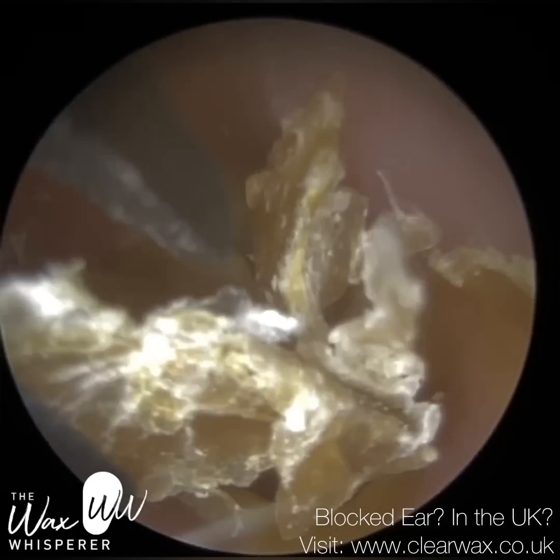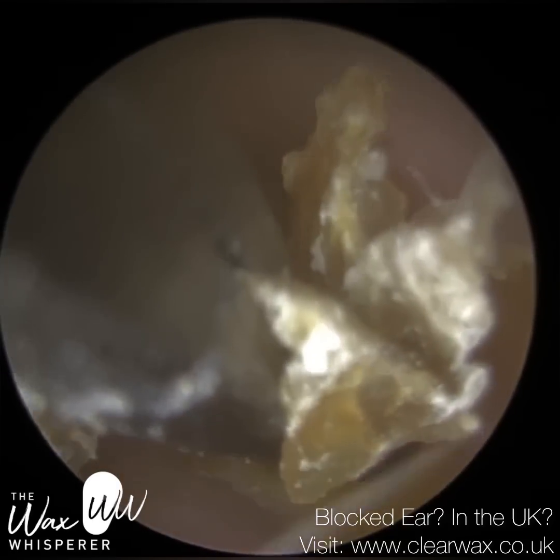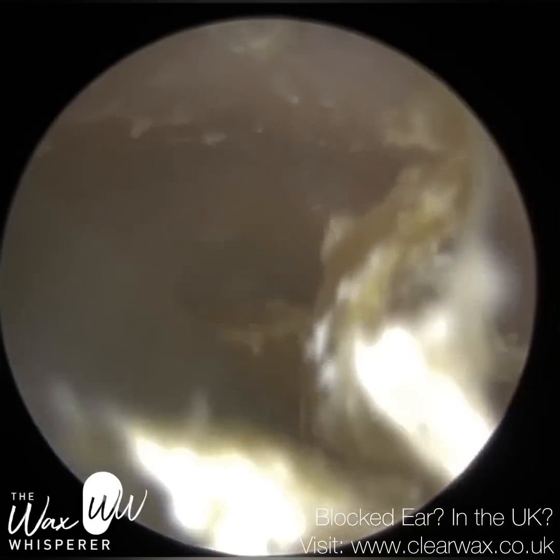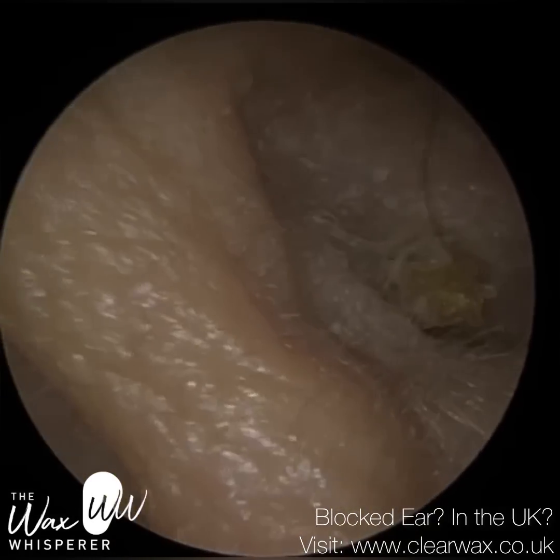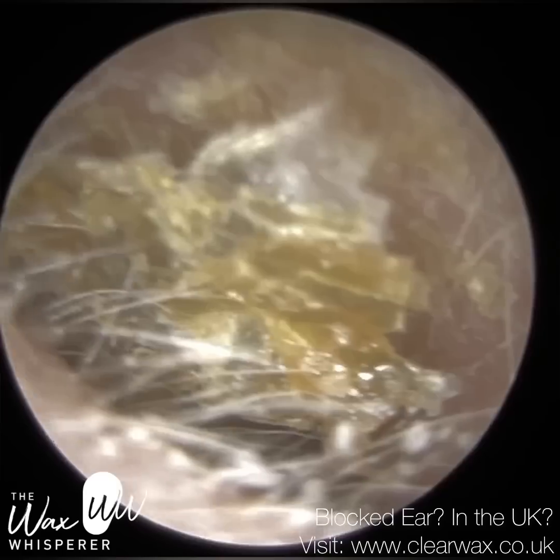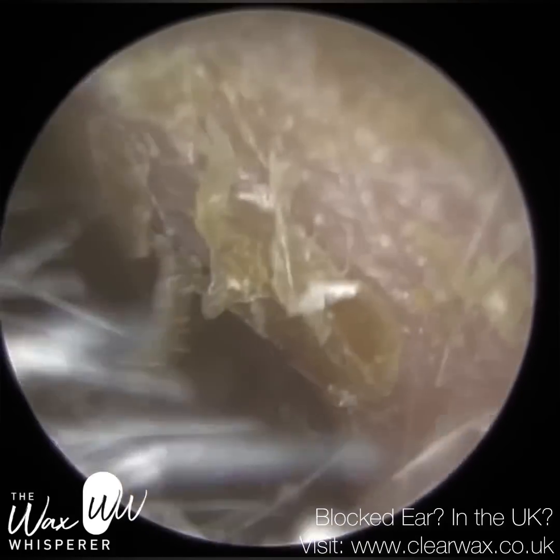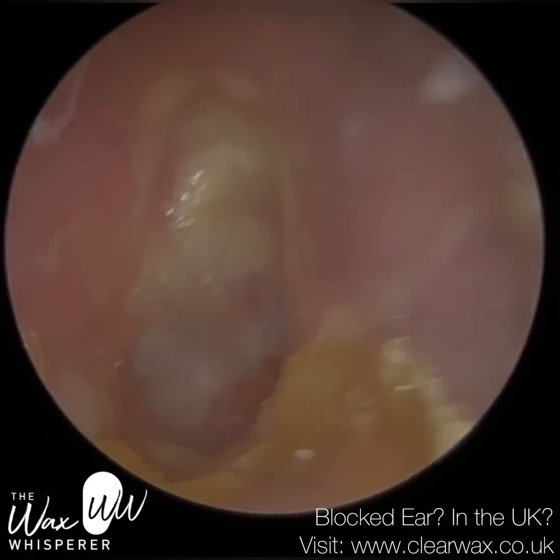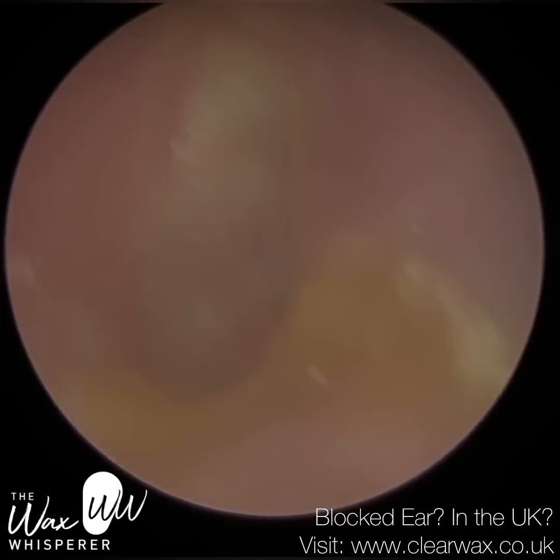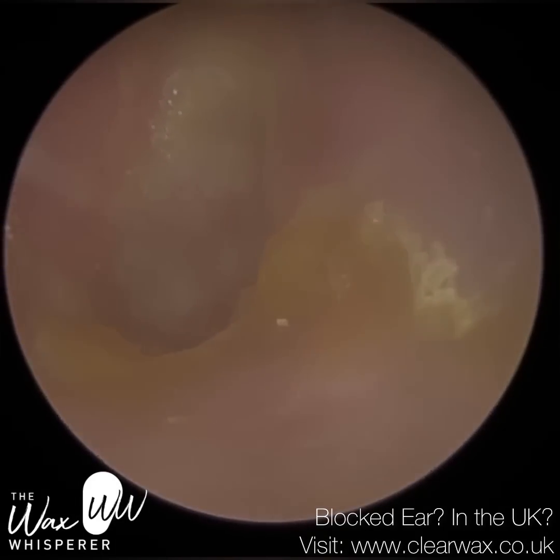So I've just reverted to the microjaw forceps. And I've rotated the forceps so the jaws are more at 3 and 9 o'clock as opposed to 12 and 6 o'clock. I've got a good grip there. I'm just bringing this out. You can see they've got very dry skin, particularly at the entrance. So it's like an eczema or a psoriasis appearance. You can see this nice, healthy ear canal underneath this skin.